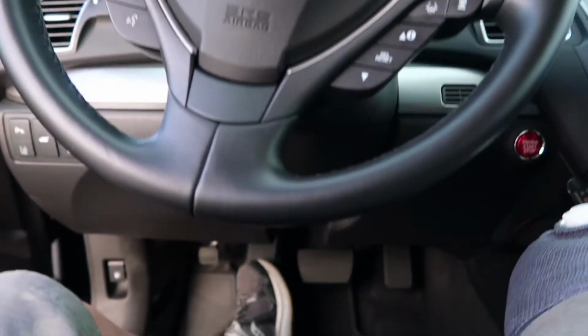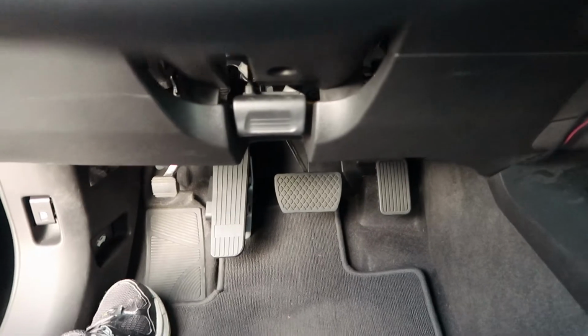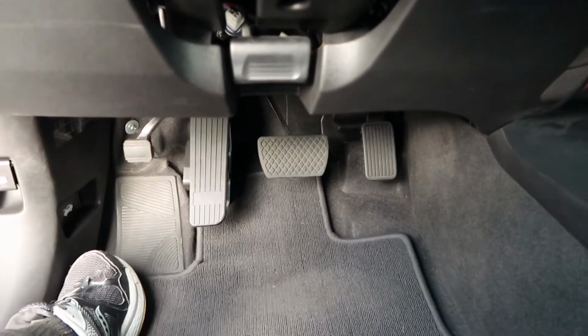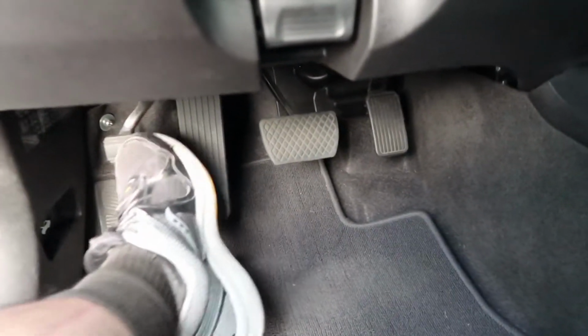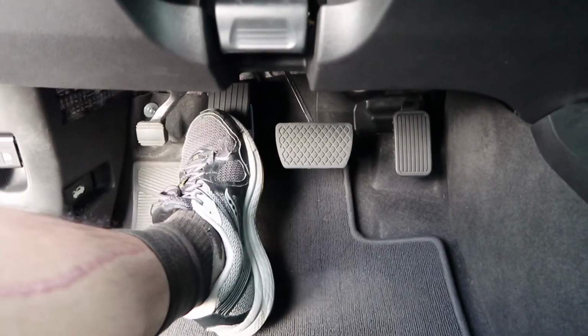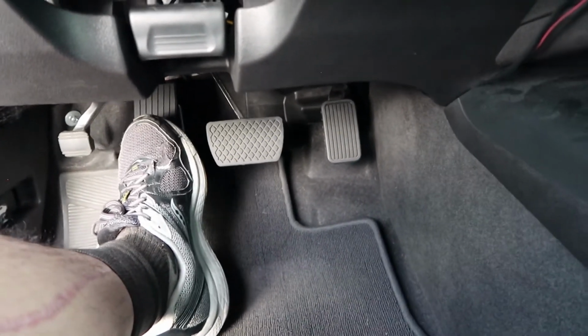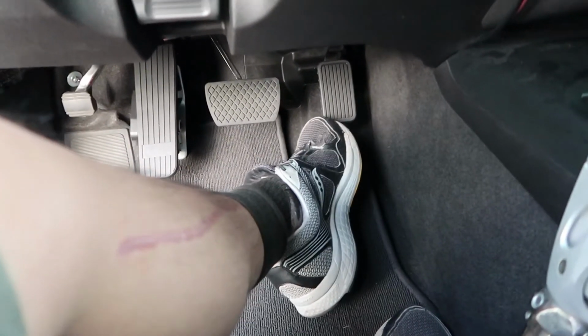Mine is made by a company called SureGrip. It was installed by Ability Center in Stanton, California. So it looks like a clutch, but it isn't. It's an accelerator for the left foot on the left side of the brake instead of using the accelerator on the right side like it traditionally is.